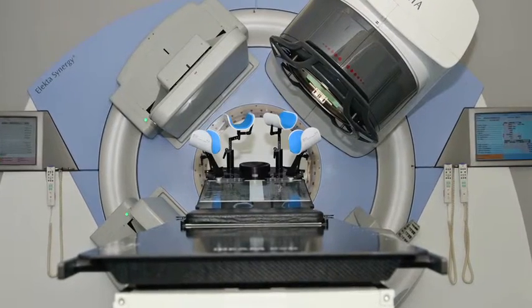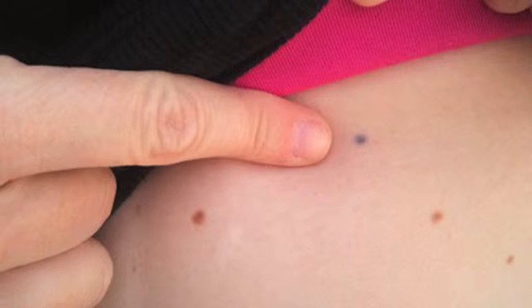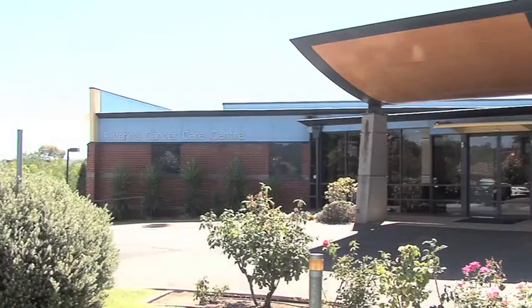Part of the session is to work out the best method of delivering the treatment. The radiation therapist may indicate that a permanent location mark is required for your treatment, and they will seek your consent for a tattoo to ensure accurate treatment setup and delivery on a daily basis. During the treatment planning session, the radiation therapist will outline a treatment schedule and provide you with the opportunity to ask questions. The number of treatments prescribed by the oncologist varies from patient to patient, and the planning session will also help determine the right number of treatments for you.